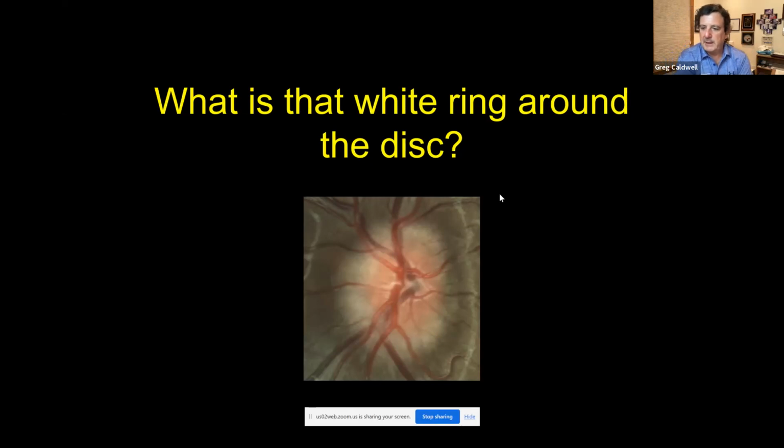And the key here, Peter, is that you have to understand the pathophysiology. These drusen, as Len pointed out, are kind of just axons that died and become fossilized. In my opinion, maybe, Len, that may not be a good way of putting it, you can clarify that, but they're a different animal.